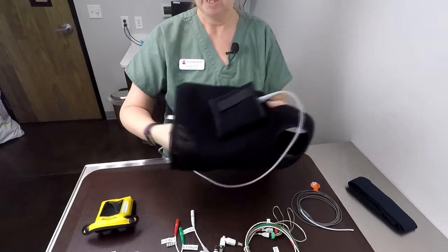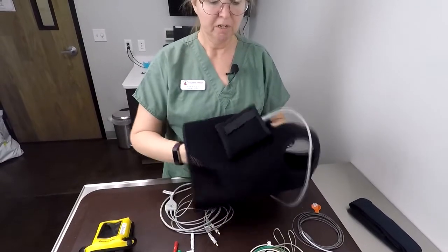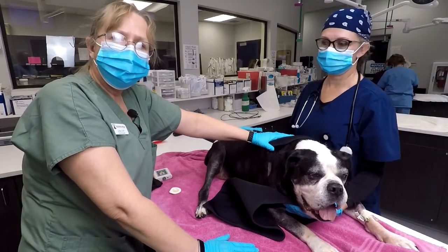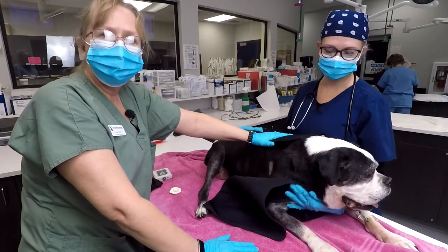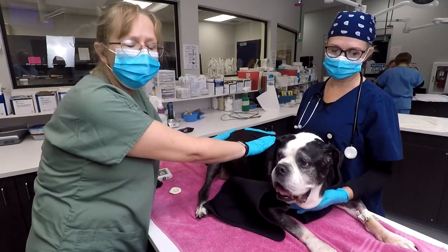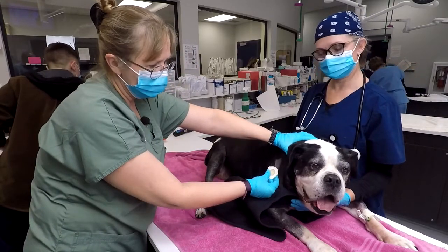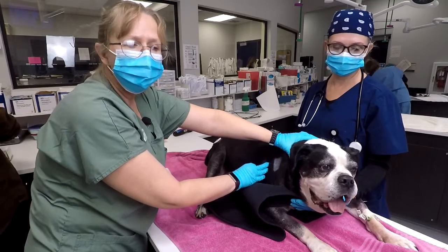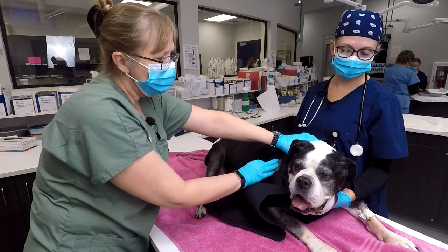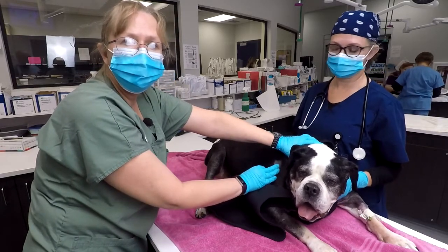This is Daisy, one of our patients in the hospital that needs continuous ECG monitoring. I've already prepped her left and right rear and placed her pads there for the electrodes. When you prep these sites, you need to shave nice and close using a 40 blade, just like you would with a surgical prep. Then make sure you clean carefully with alcohol pads or alcohol spray and gauze.